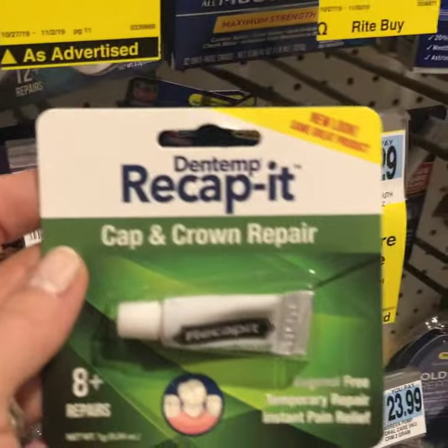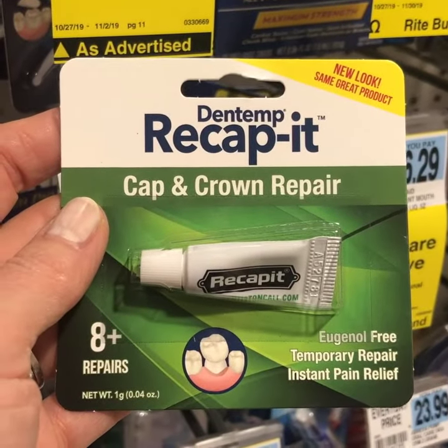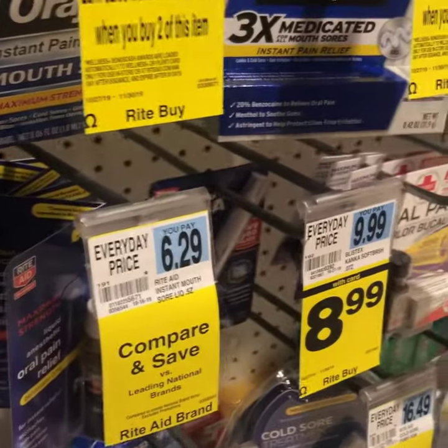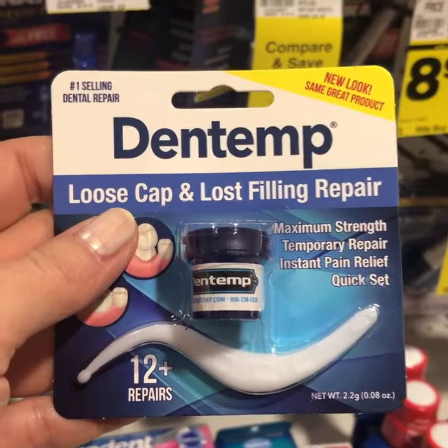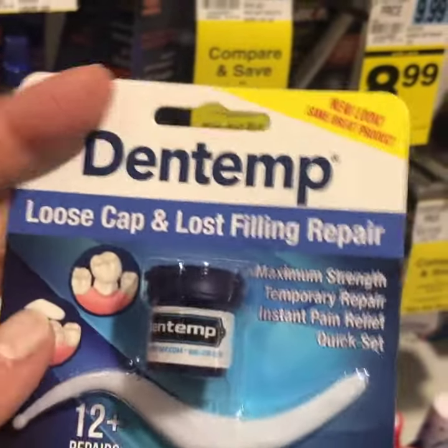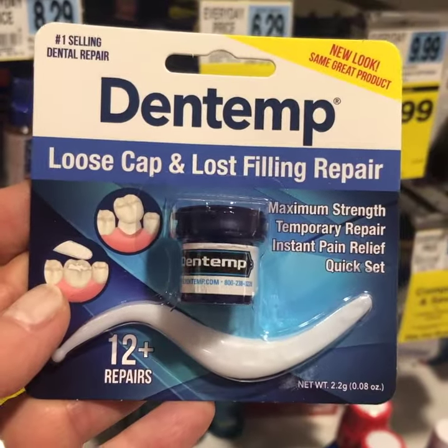So to recap, this is one type of cement for loose crowns, and the other would be, for example, this one here — Dentemp — which is a putty that you can put in your crown and re-cement it back on.